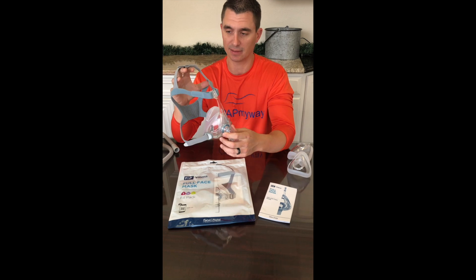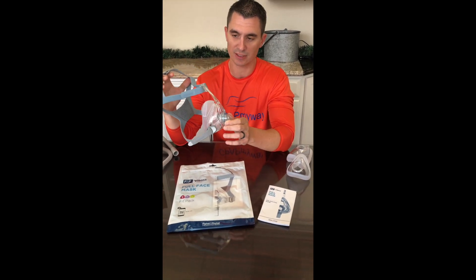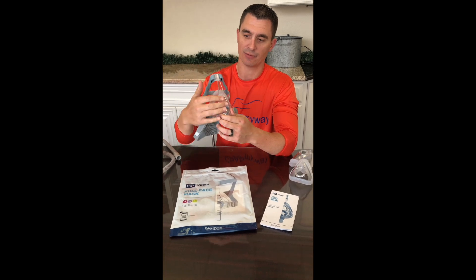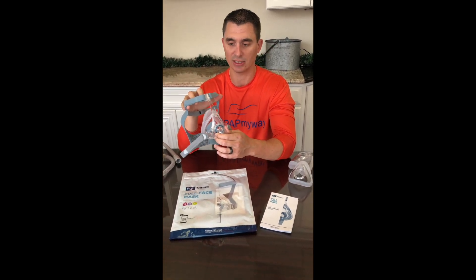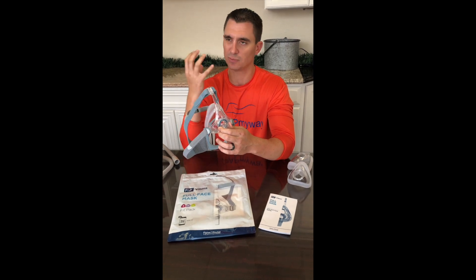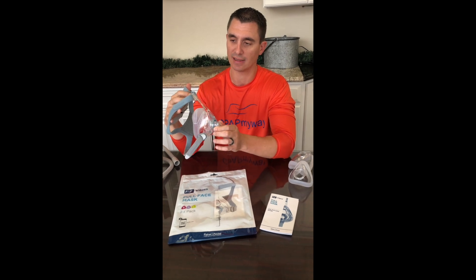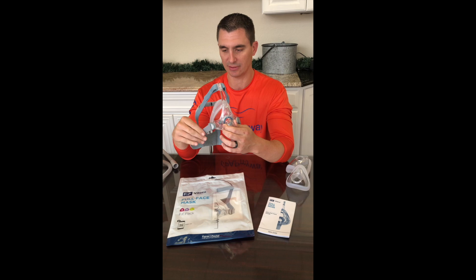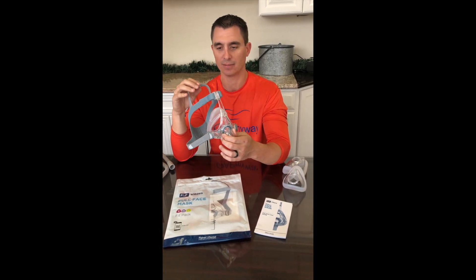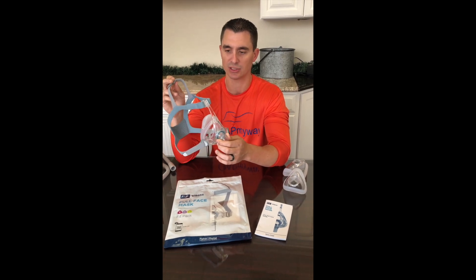First and foremost, much like the Simplest, you'll notice it's a very standard full face mask in that it has a frame that comes up to the forehead, which is great for stabilization. If you're using a minimal mask and it's moving around your face a lot, you really should consider a more classic stable fit like this. You've got four-point headgear — four points of adjustment that allow you to really keep it adjusted to the face and in the same position throughout the night.